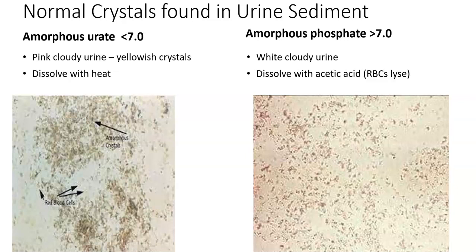When you use acetic acid solution to dissolve amorphous phosphates, it will also lyse any red cells present. You want to make sure you can identify any red cells first — confirm your blood on the dipstick was negative before dissolving them, or run two separate microscopics: one looking for and counting red cells, and one where you clear out the amorphous phosphates and look for everything else.